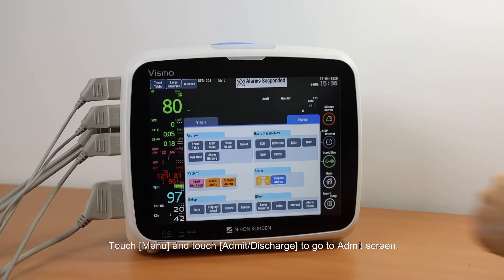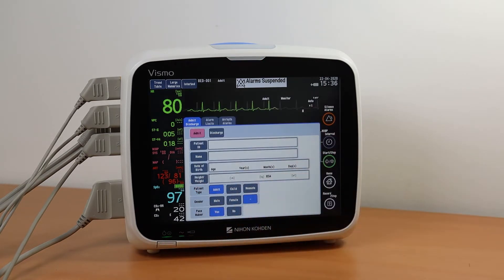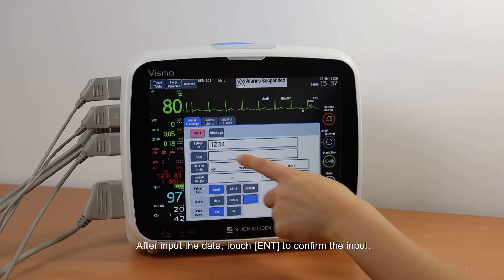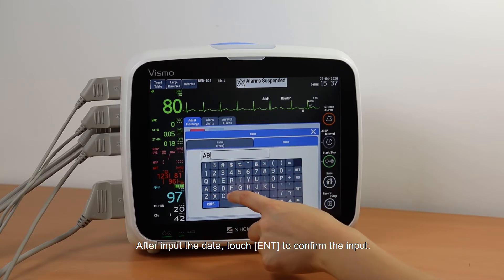Touch Menu and touch Admit/Discharge to go to the Admit screen. Enter the patient information by touching items and entering data using the keyboard. After inputting the data, touch End to confirm the input.